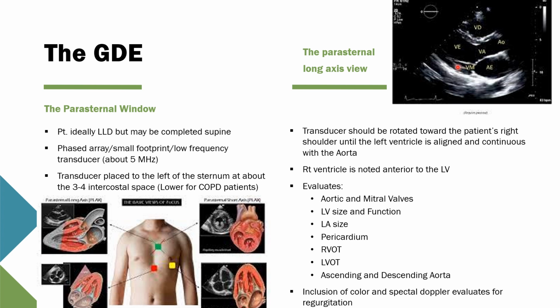You're able to evaluate your blood moving out of that left ventricle through the aortic valve into the left ventricular outflow tract or aorta. Sometimes you'll be able to identify some significant pathology on that aortic valve as well in this view. You're also able to watch the contraction of that wall and identify if you have any major defects in the contractive ability of both the septum and the posterior left ventricular wall. Now, the right ventricle is noted anterior to the left ventricle in this case.